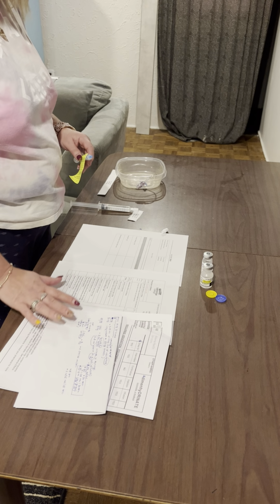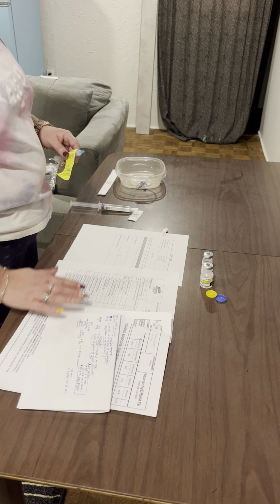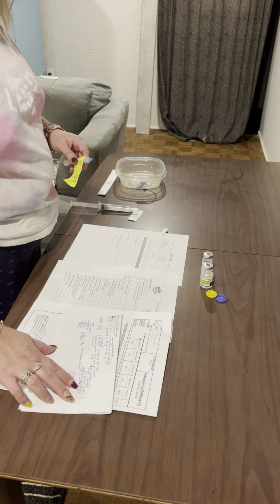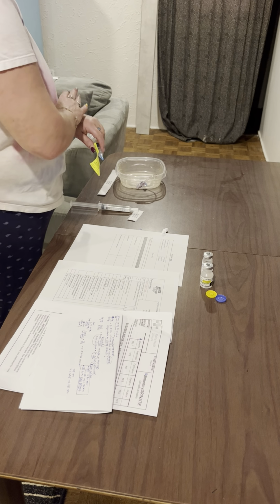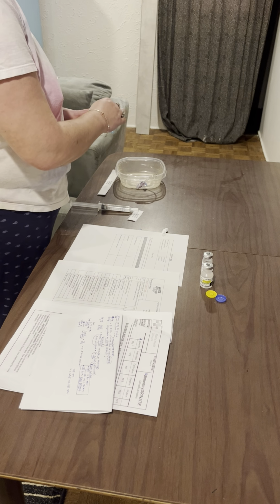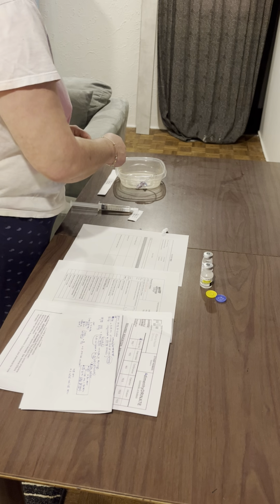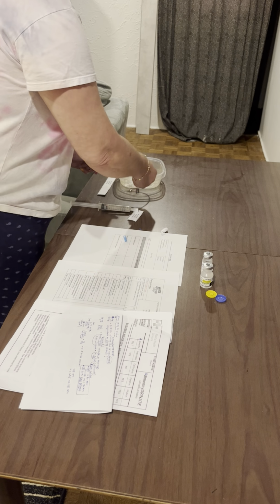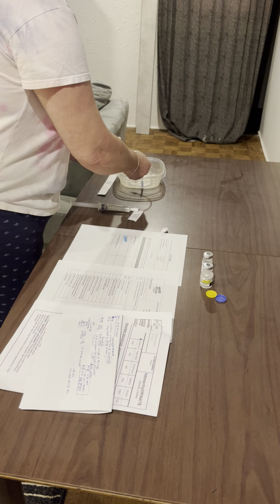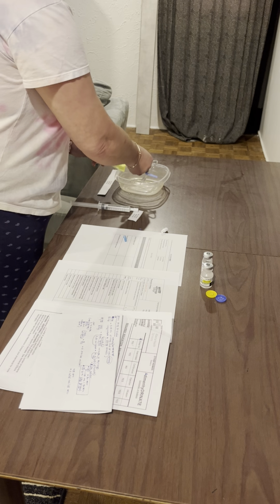And as per orders and our med math, we are going to give the medication at 1 ml every 30 seconds. So we're going to use our watch here, and when we start giving the medication, we're going to do it per mil, which is why we didn't put the label over it. So we've swabbed our port, going to uncap, and we're going to attach to the patient here. So we're just going to push and twist.